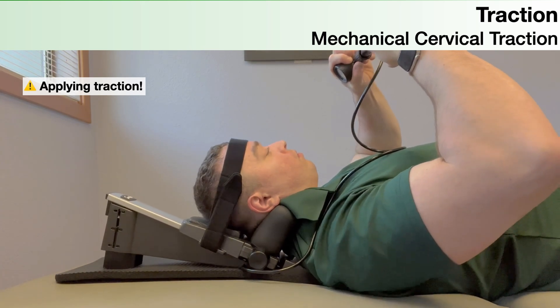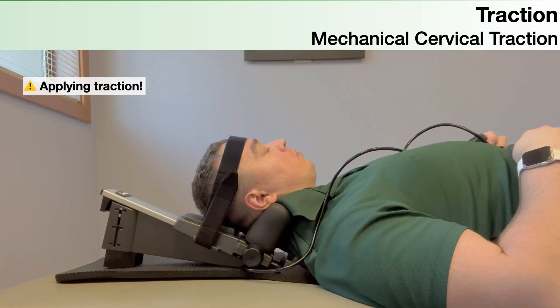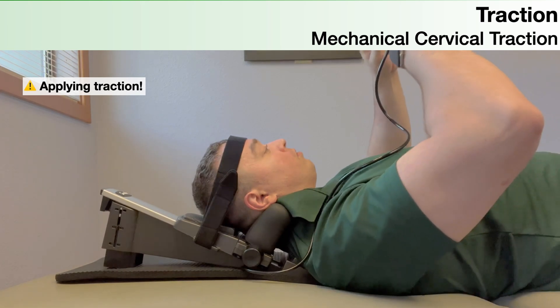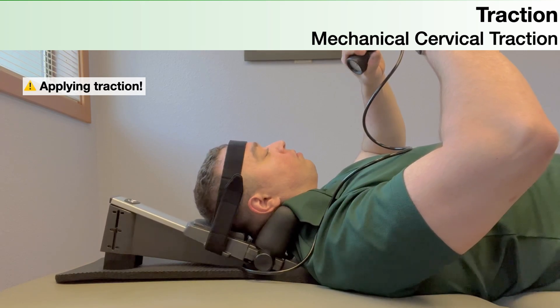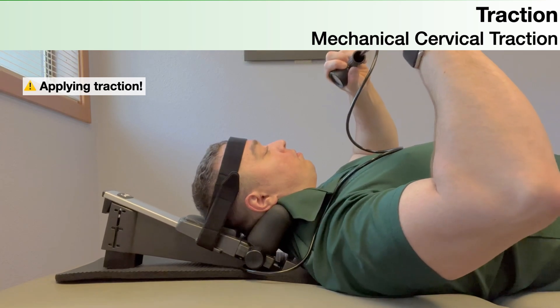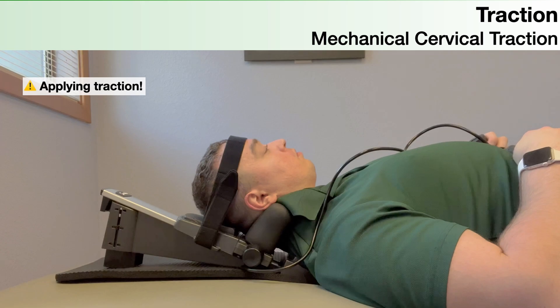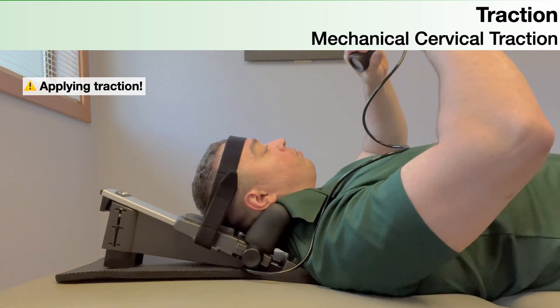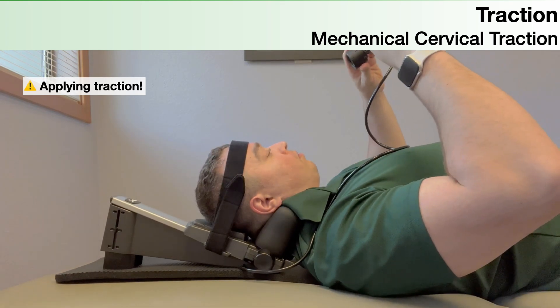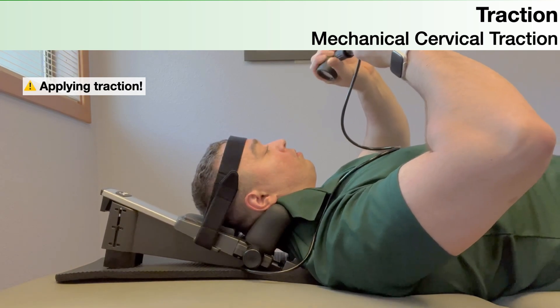Use the pump to increase the force of traction, monitoring it on the gauge attached to the side of the pump. The first time you give somebody mechanical cervical traction, use about 20 pounds of force. The dosing is typically two sets of three-minute static holds separated by a one-minute rest break. Pump to 20 pounds and hold for three minutes, release fully for one minute rest, then pump back up to the same force or slightly more — maybe 25 pounds — and hold for another three minutes.